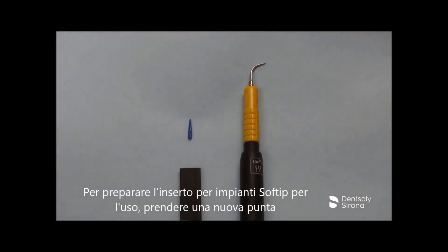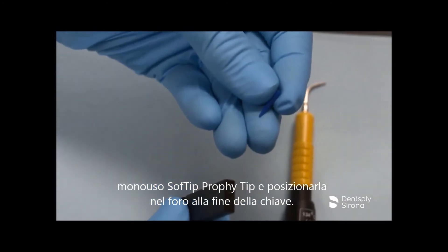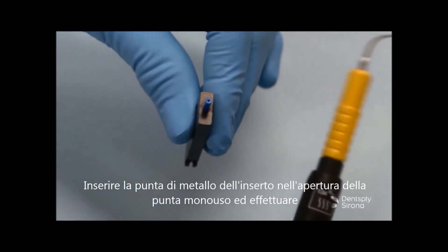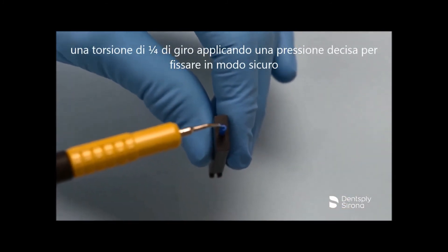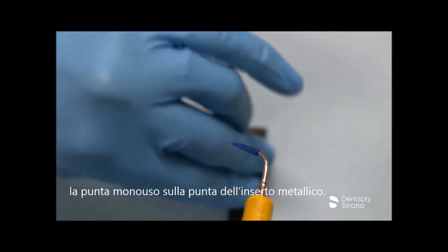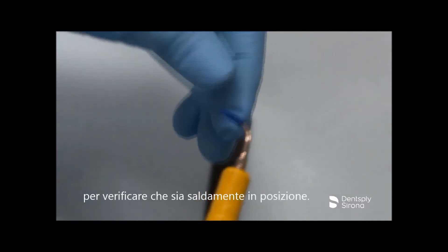To prepare the Cavitron Ultrasonic Implant Insert for use, take the new plastic Soft Tip Disposable Prophy Tip and place it point first into the hole in the end of the wrench. Insert the metal tip of the insert into the opening of the prophy tip and twist one-quarter turn while applying firm pressure to securely seat the disposable prophy tip on the metal insert tip. Disengage the prophy tip from the wrench and gently pull on the prophy tip to verify that it is securely in place.